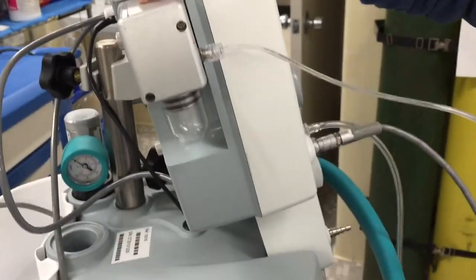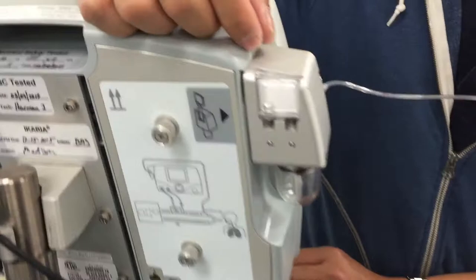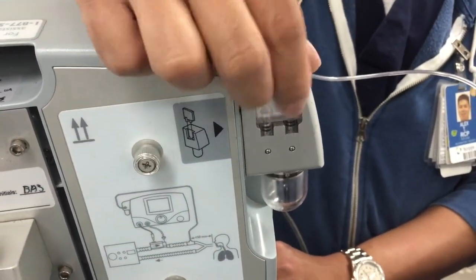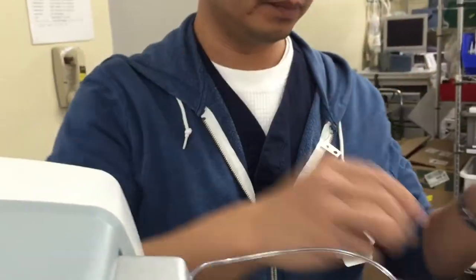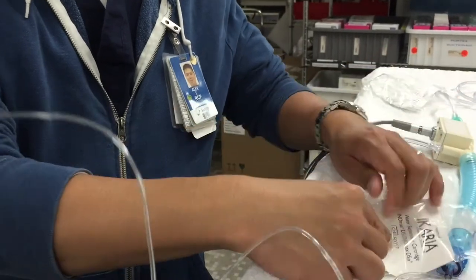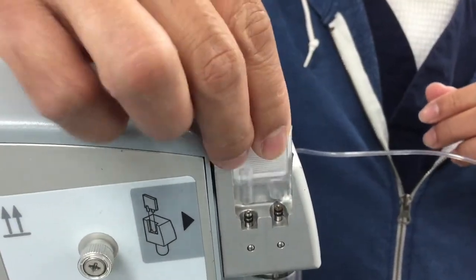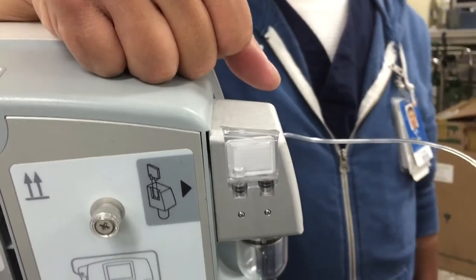Now behind the sample port is a gas filter that we have to replace. All you have to do is grab that little ledge, pull it up, discard it, and replace with a new one. Just press it down. There you go — now your machine is all set up.